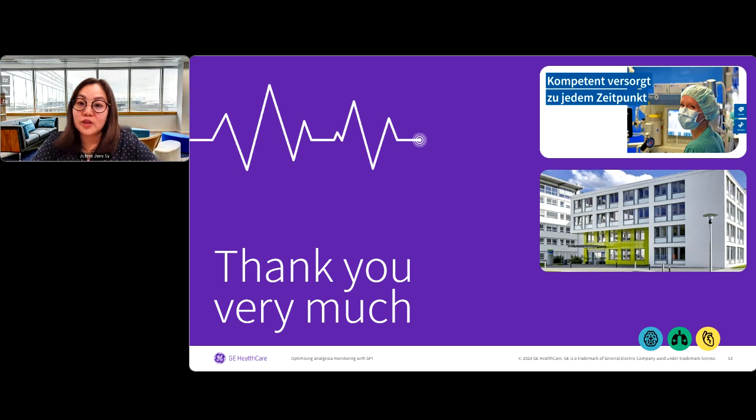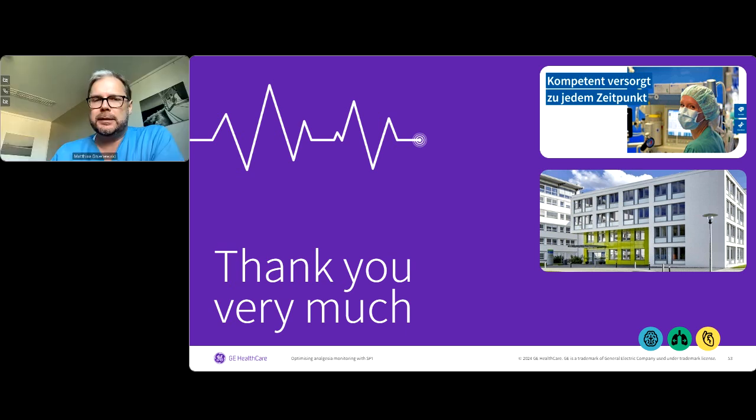So how much of an increase in SPI, and how high should the variability be in the SPI value before we should react to this? Yeah, this was one of the tricky tasks in our multi-center trial. And I wish we could do it again, but it was a high effort, especially combining 4 university centers throughout Europe. My suggestion would be the signal needs about 20 seconds to calculate and react.